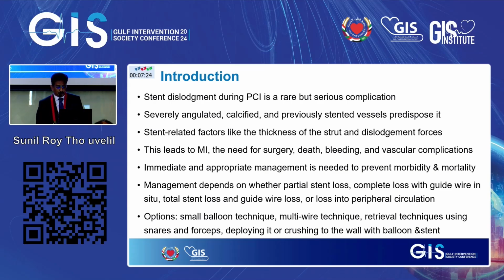This can lead to myocardial infarction, need for surgery, death, bleeding and vascular complications, and if it travels to the periphery, it can produce stroke and distal embolization. Immediate and appropriate management is needed to prevent morbidity and mortality.